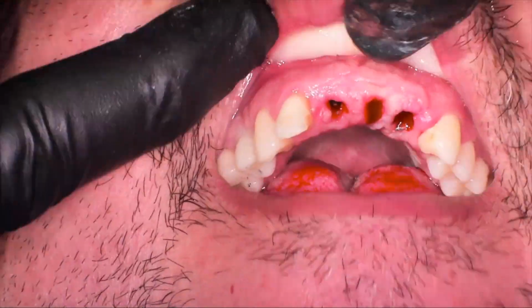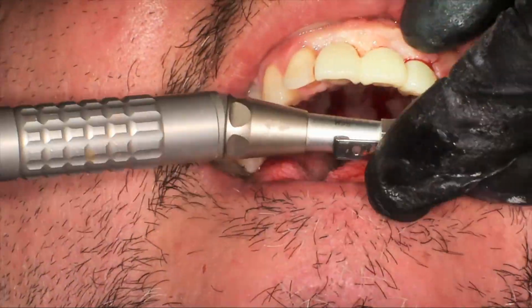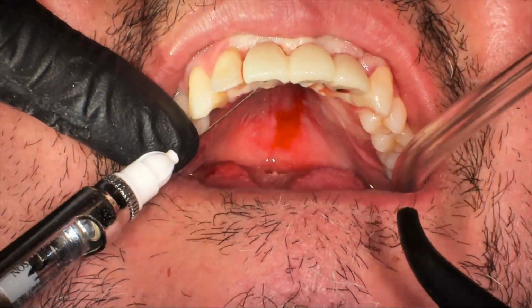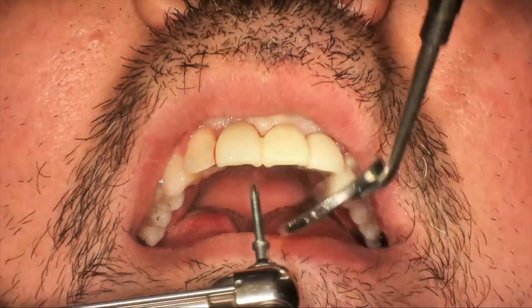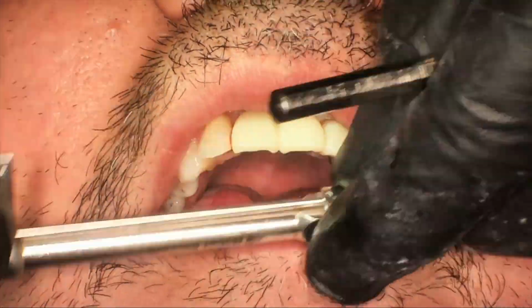So here we've got that completed, and now we're going to go ahead and seat our bridge, and now we can see that it's completely seating, and we're going up into that ovate Pontic site. We're going to test everything out. Patient's feeling a little needs a little bit more anesthetic, and now we're going to torque these into place. Going to torque these to final torque pressure, in this particular case 35 Newton centimeters.